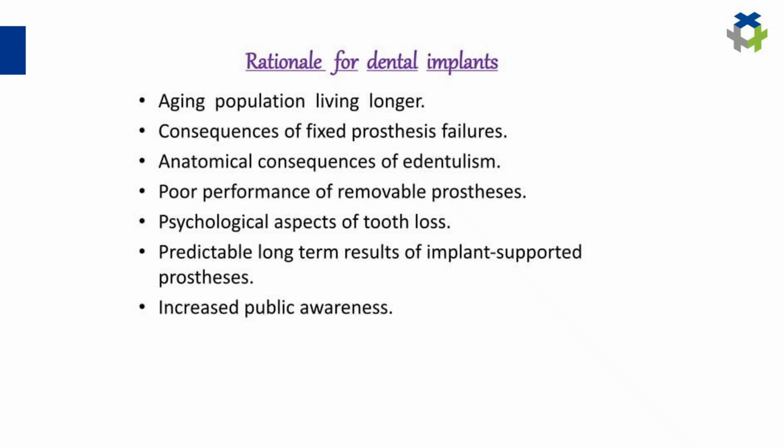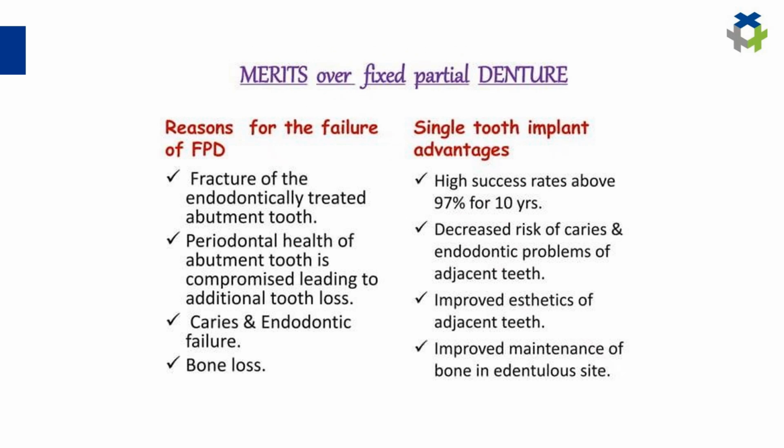So what is the rationale for dental implants? Aging population living longer, consequences of an FPD, fixed prosthesis failure, anatomical consequences of edentulism, poor performance of a removable prosthesis, psychological aspects of tooth loss, predictable long-term results of implant-supported prostheses, and increased public awareness.